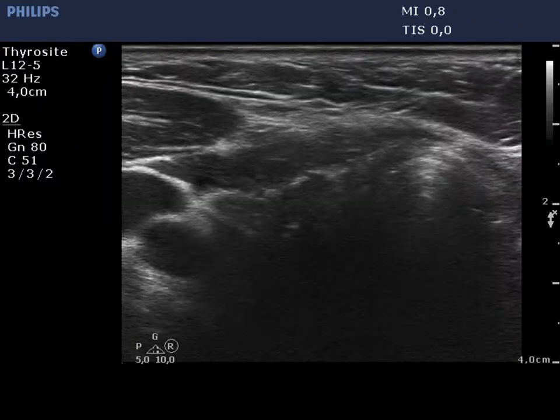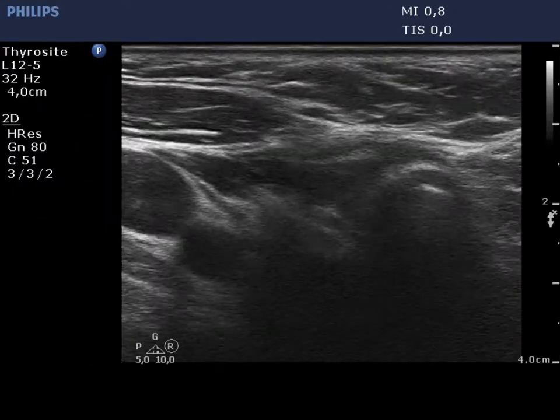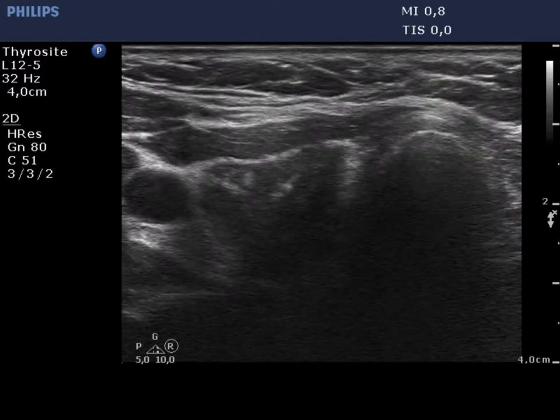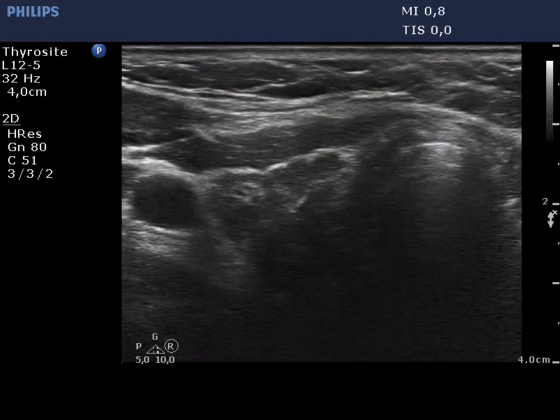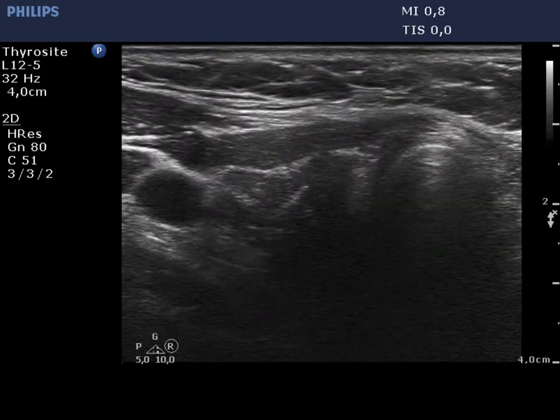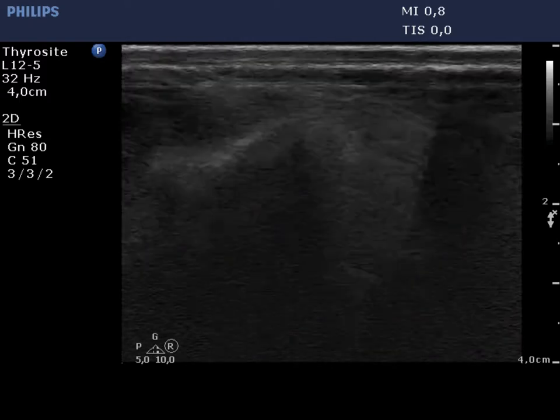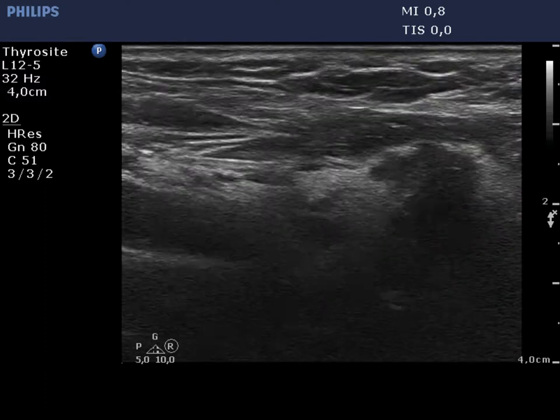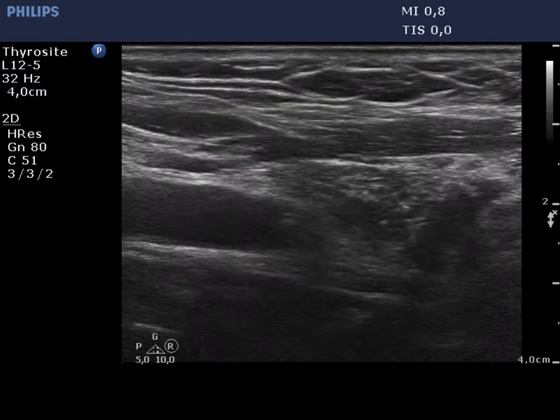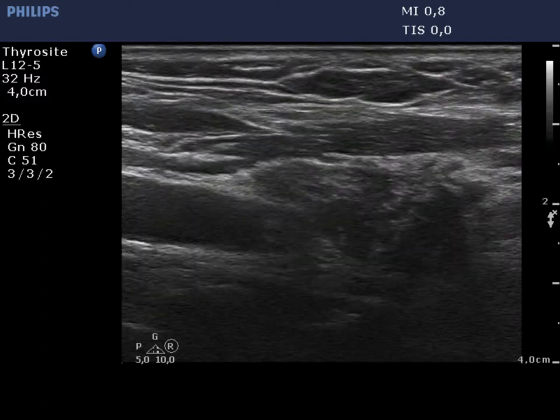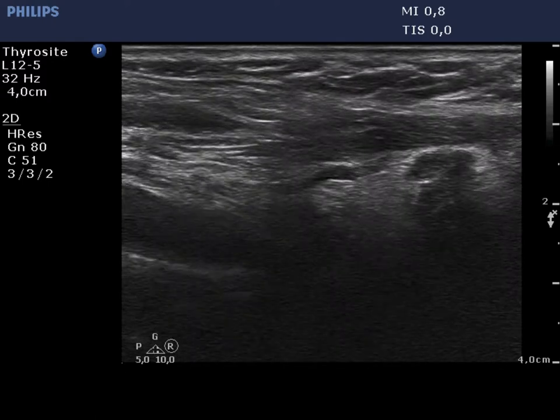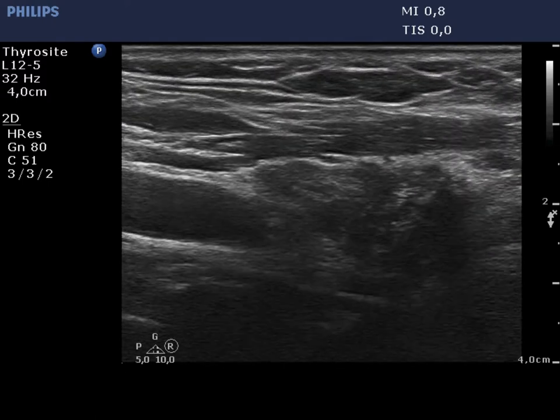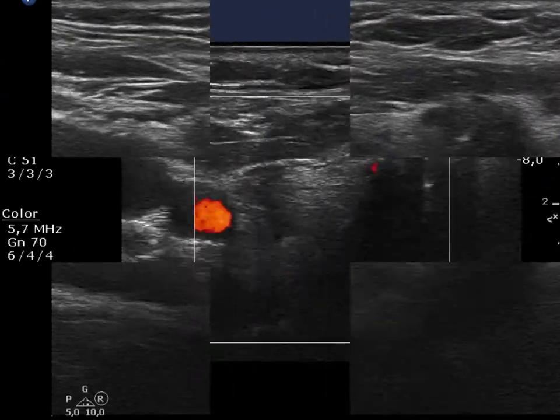The atrophic right lobe is presented. The lobe is mainly composed of hypoechoic areas with irregular, infiltrative borders and shape. Note ragged small echonormal areas. This is a typical presentation of Hashimoto's thyroiditis.